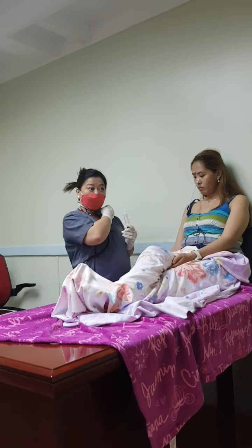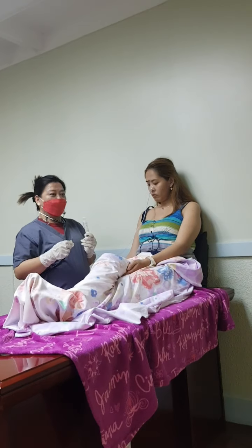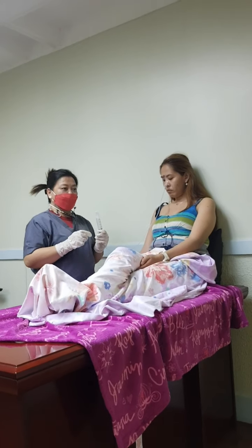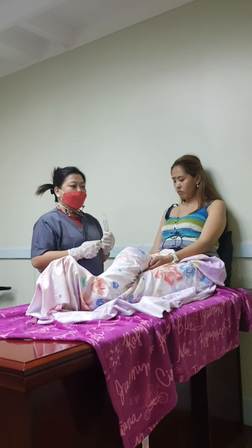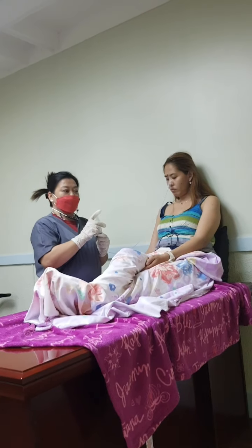If the tube is in the stomach, you will be able to hear the air enter, a whooshing sound. If the tube is in the esophagus, injecting the air will be difficult or impossible. In addition, injection of air often causes the client to belch immediately. If the tube is in the larynx, the client usually is unable to speak.